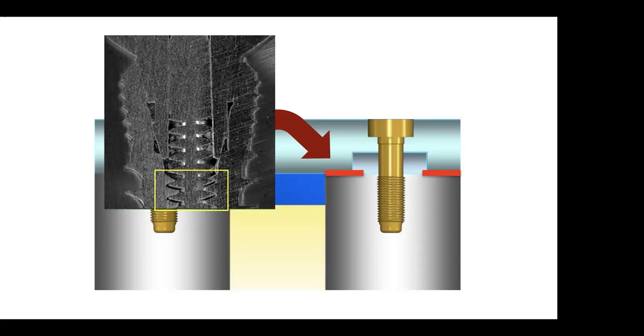But let's say you close the gap just a little by tightening the screw, right? Because you tighten the screw, it'll bend the frame and those abutments will come closer to the platform. But those two interfaces are still not in contact. What happens to the screw when the prosthesis is pressed down by the external forces?